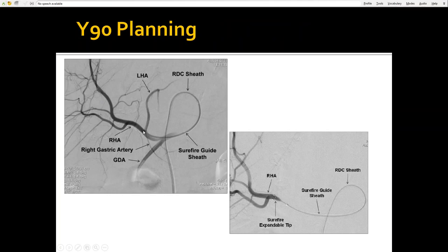Sometimes now we're able to avoid having to go too deep, or to have to embolize all these arteries. Because if, let's say, the tumor is way up here and it's being fed by this branch, then you could get by with maybe not having to embolize these, because the chances of reflux all the way from up here are pretty slim, and the likelihood of particles going places where you don't want them to is really low.